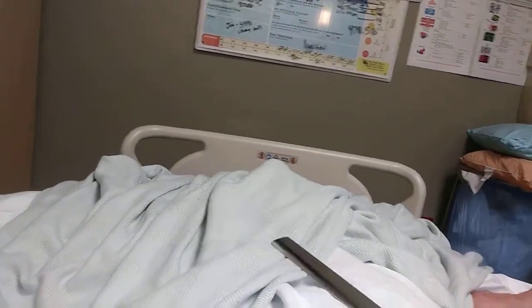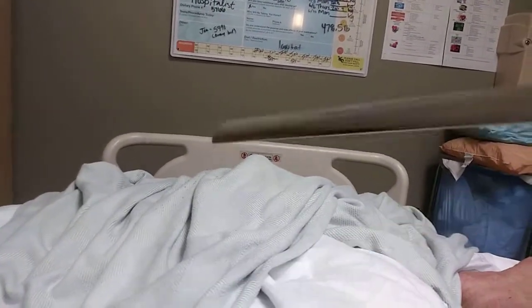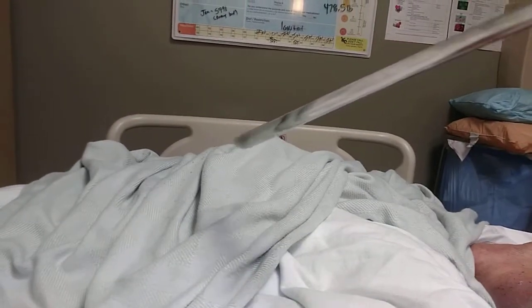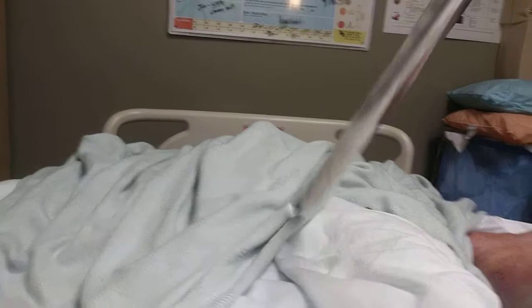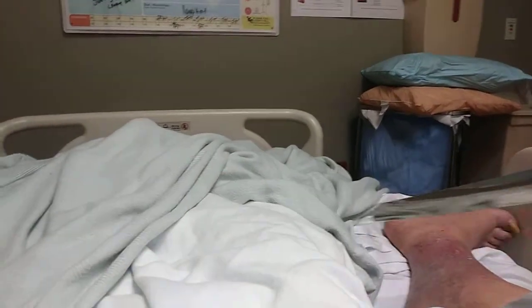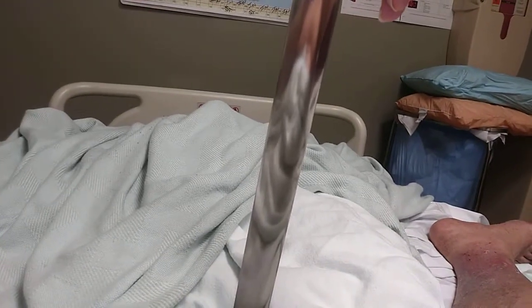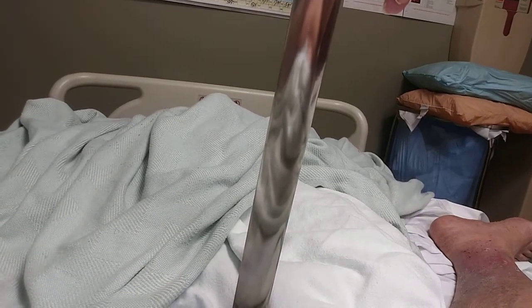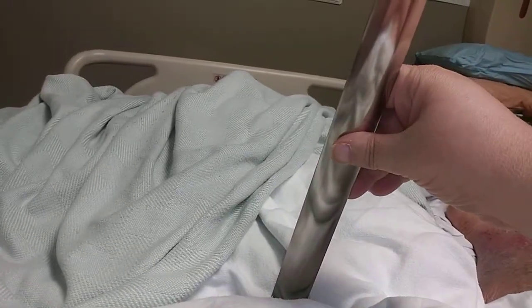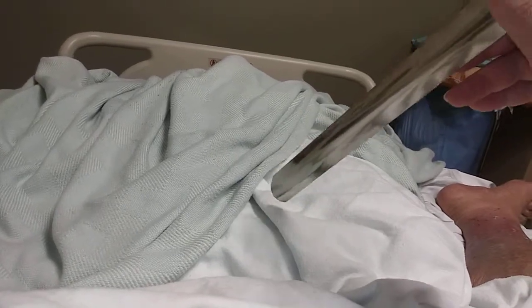Anyways, I don't know if it's self-explanatory or not, but for the lame people out there like myself, who had to be explained how this works, I wish I had a shoe to show you in, but I don't. This goes in where the heel of your foot hits the back side of the shoe, after you put on your sock, of course, because your skin won't rub against this metal too easily without some kind of slippery cloth on your foot. It helps bring your shoe up and around the back of your heel when you're trying to dress, if you can't reach your shoes with your own arms and hands. So that's that.